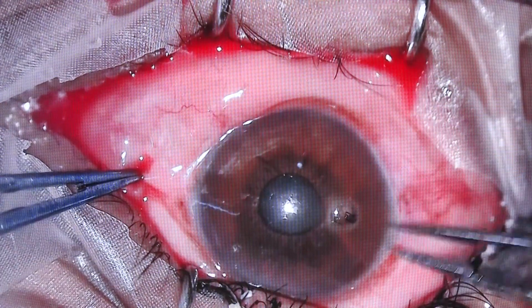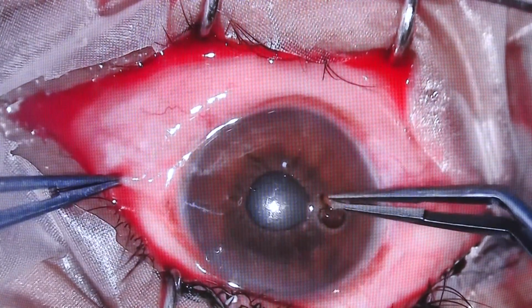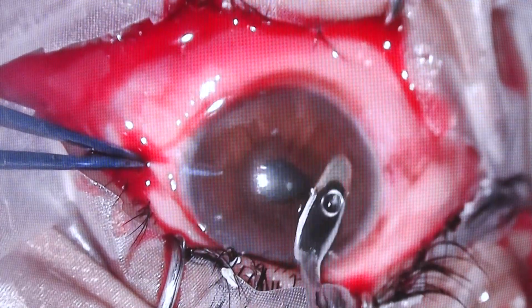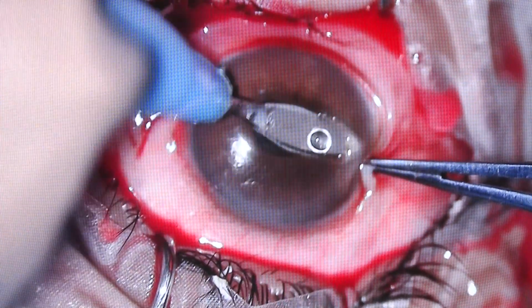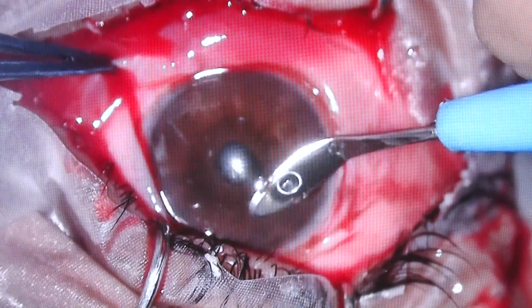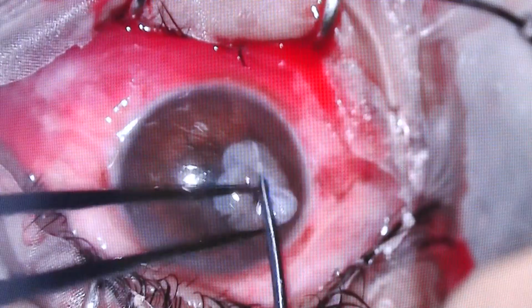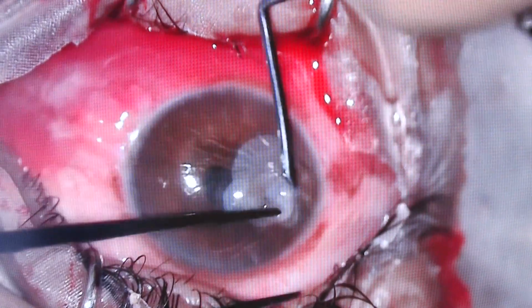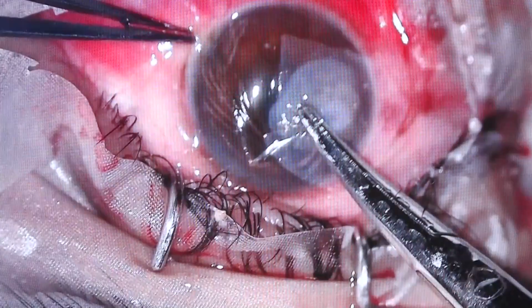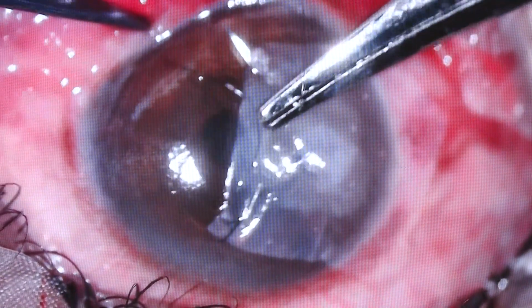So on removing, I saw a residual foreign body still there, and there was a perforation which could not be handled with cyanoacrylate glue. So a lamellar pocket was made here so that I could do a multi-layered amniotic membrane. The first layer was inserted into the pocket with glue and then covered with a second layer with glue and sutures.